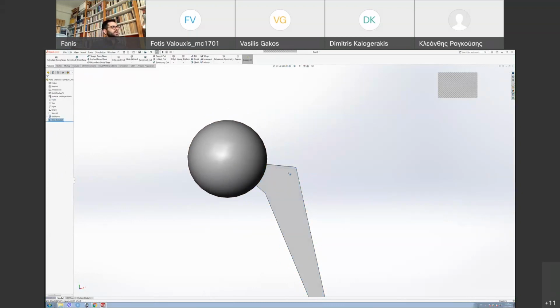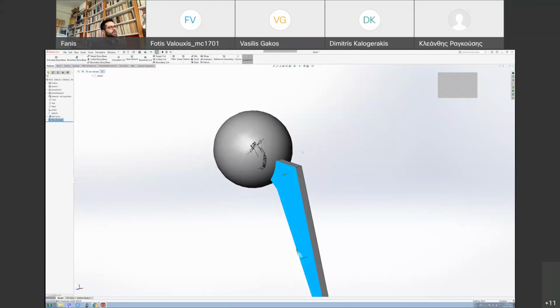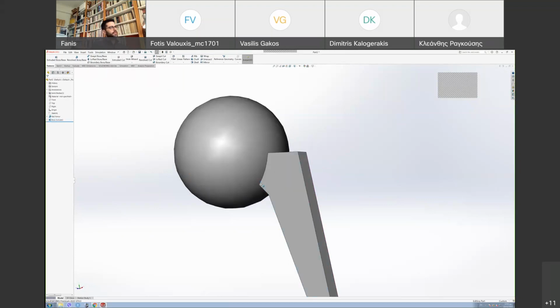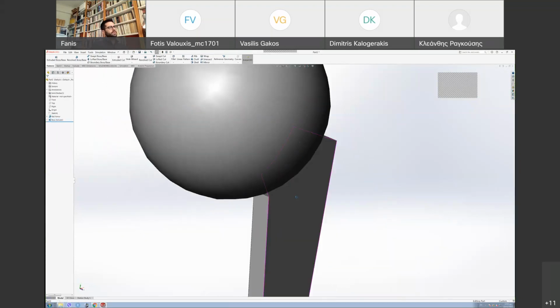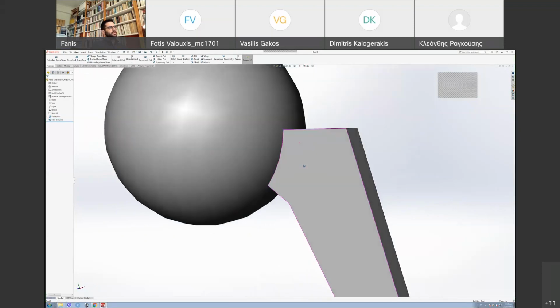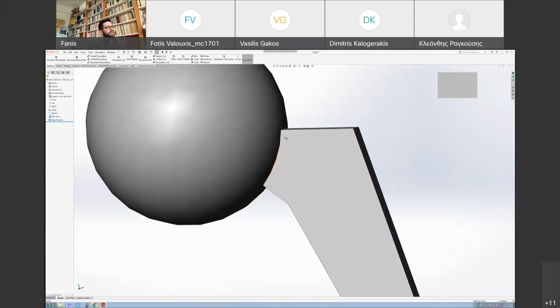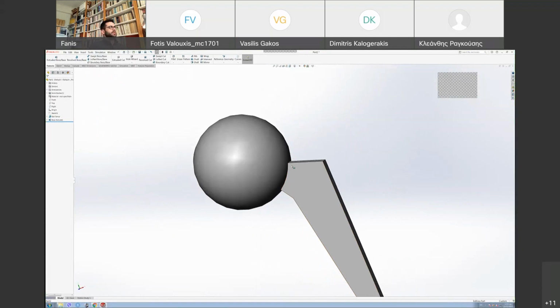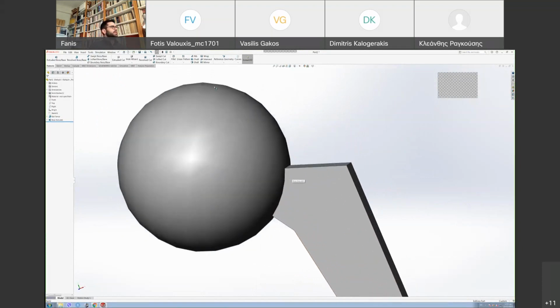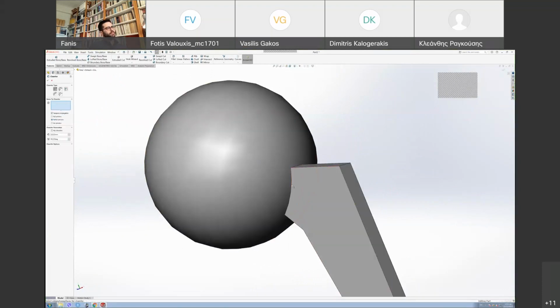And if I merge the result, you can see that this body now no longer interferes with the sphere. And at the same time, it comes in contact throughout this. I don't have any, let's say, blank spots or whatever that are gonna cause an issue during the meshing process later. Also here, you can go ahead if you want and just put some chamfers and fillets around here, okay? Now 10 millimeters is a really big one, let's say half a millimeter or something.